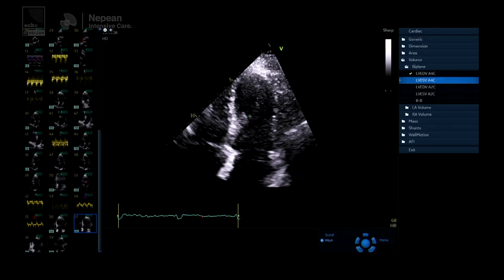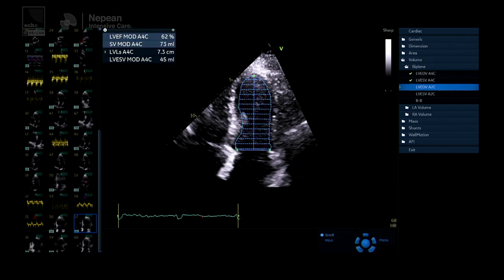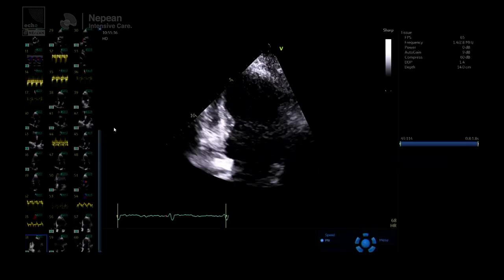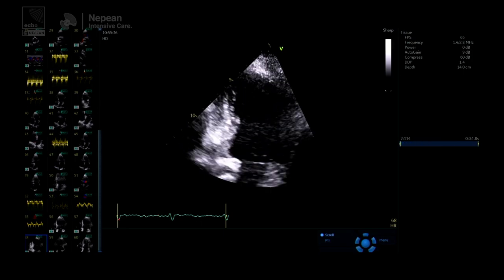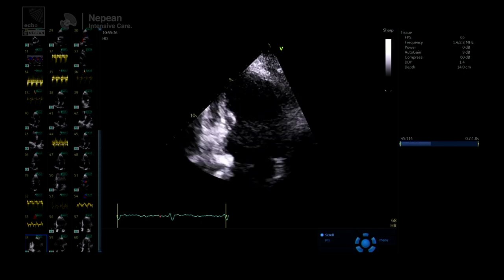Louise has traced the four chamber in diastole to get a volume, and now she's doing the same in systole — tracing as best she can that tissue-blood interface. The machine works it out using a method of discs: each disc has an area and a height, and the machine works out the volume of each disc using a mathematical equation with geometric assumptions about the shape of the left ventricle.